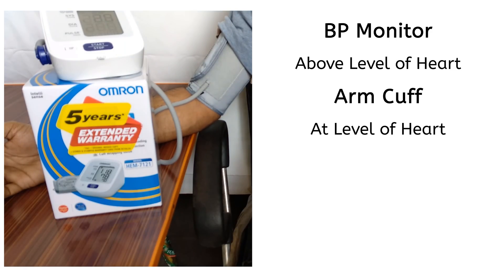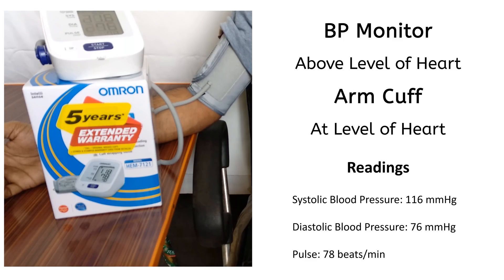This position is with BP monitor above the level of heart and the arm cuff at the level of heart. These are the readings on the monitor.